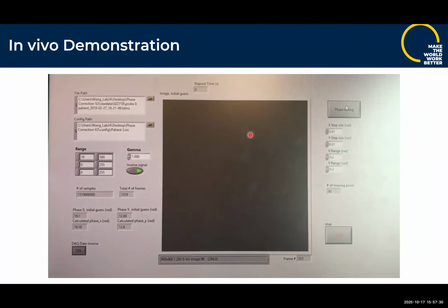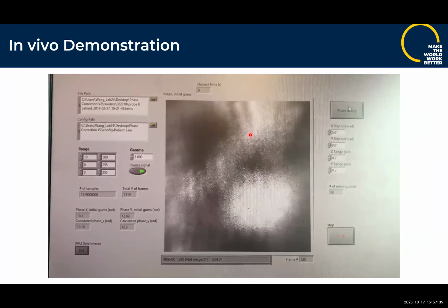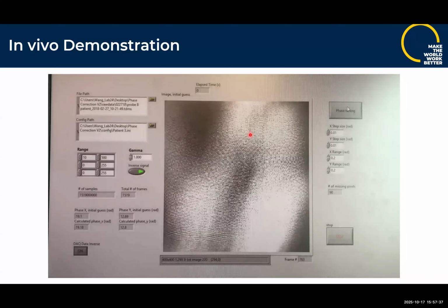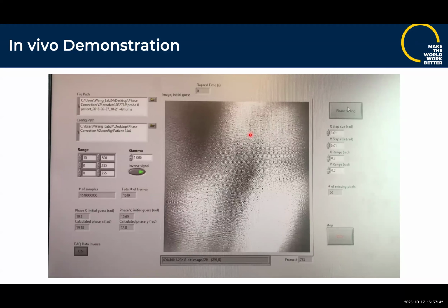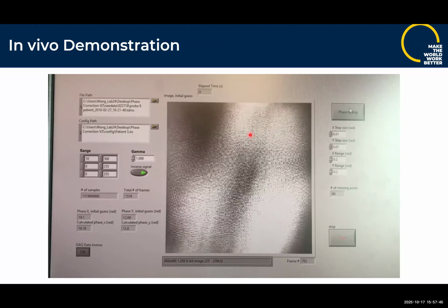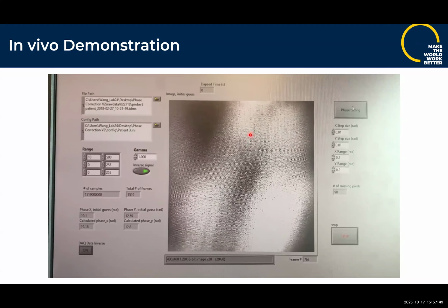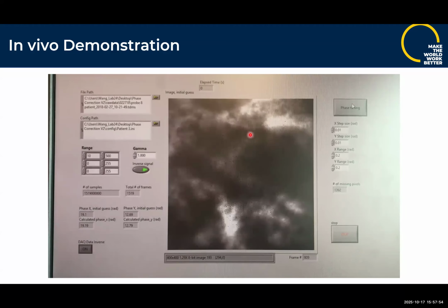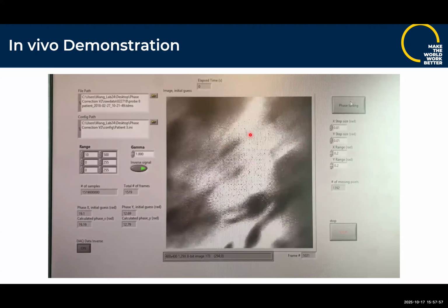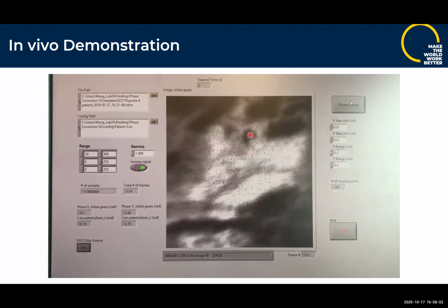So this is a data set. Sorry, this is not a simulation. This is real data where Meyer and one of Tom's students are working on imaging in vivo in a mouse model for cancer. They get a brief enough image that's good enough that they can run this algorithm on, very blurry. They run it. This was early, so it wasn't particularly fast. And then once they've identified this phase, they can bring in pretty well focused images as they move the probe around the colon of this mouse.